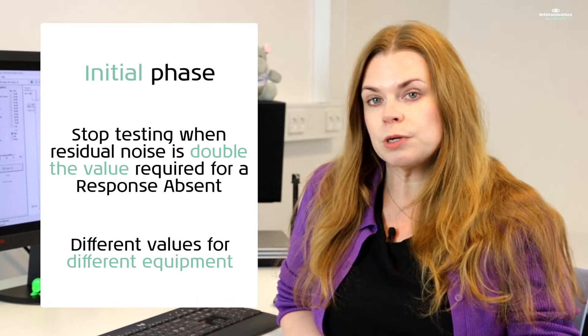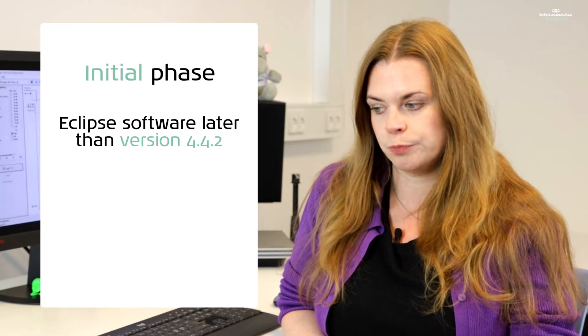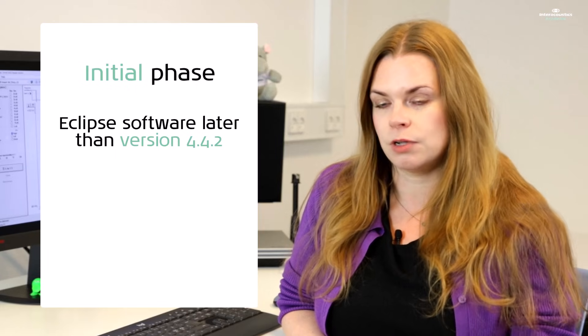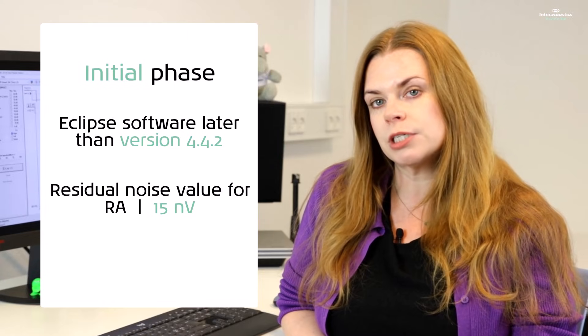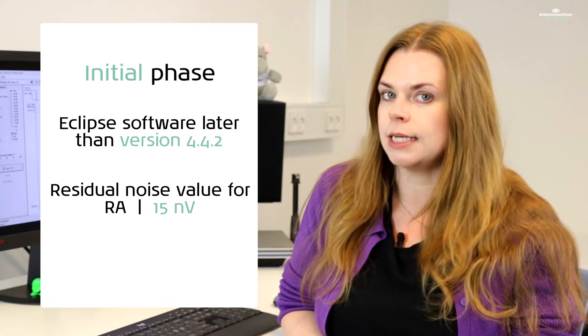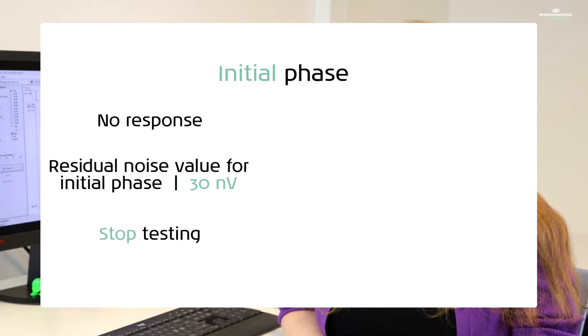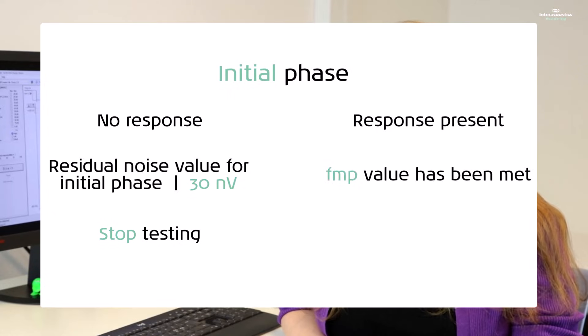In this case, we refer to the Eclipse values for software versions later than 4.4.2. The residual noise level required for an RA is 15 nanovolts. Therefore, in our first look initial phase of testing, we will average until we reach twice this — 30 nanovolts. This is the recommendation for when there is no visible response within the waveform. If the waveform appears to be a clear response, then you do not need to keep averaging until you reach 30 nanovolts of residual noise. You can instead stop testing earlier when the FMP value is met.